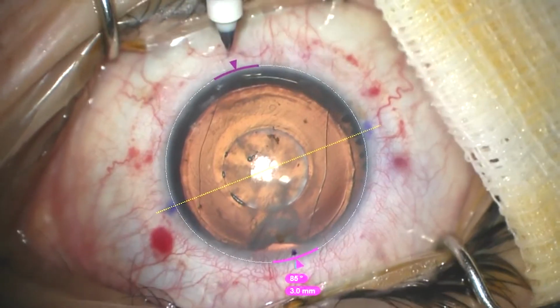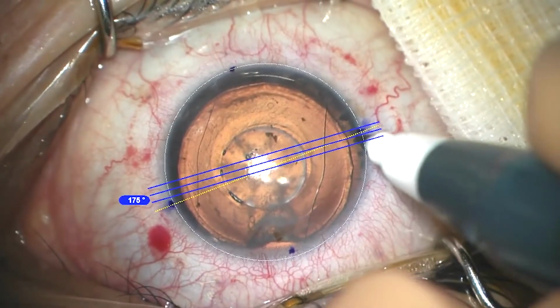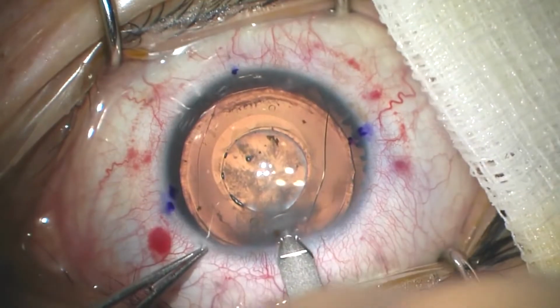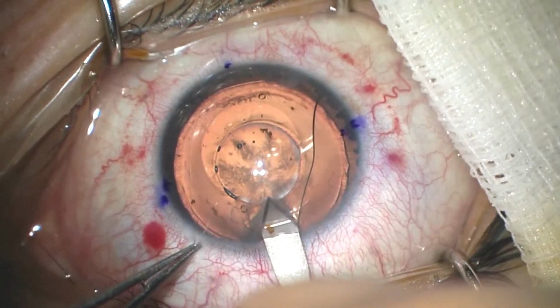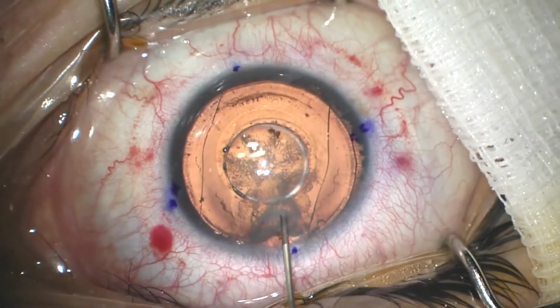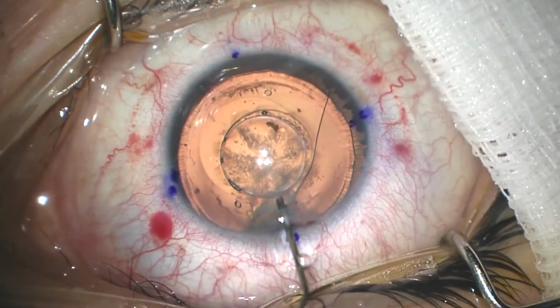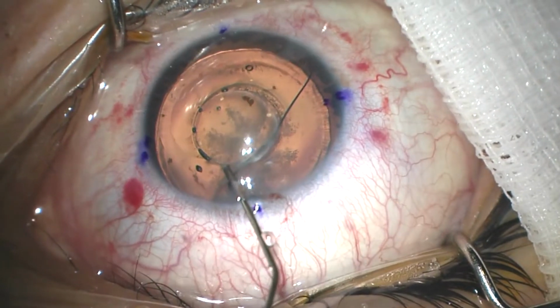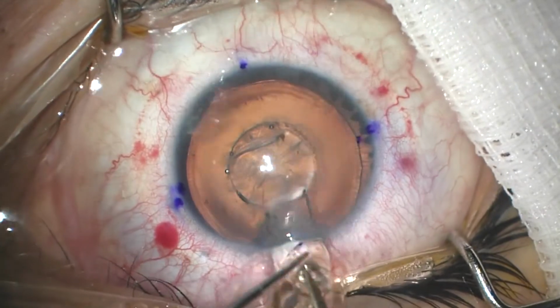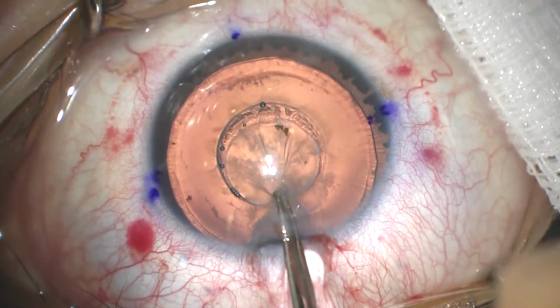Mark the steep and flat corneal meridians, in this case assisted by a digital system of image analysis. Perform the corneal incision in the steep meridian. Inject the cohesive viscoelastic above and below the ICL. Explant the ICL through a 3 mm incision with a capsulorhexis forceps. Remove the anterior capsule.